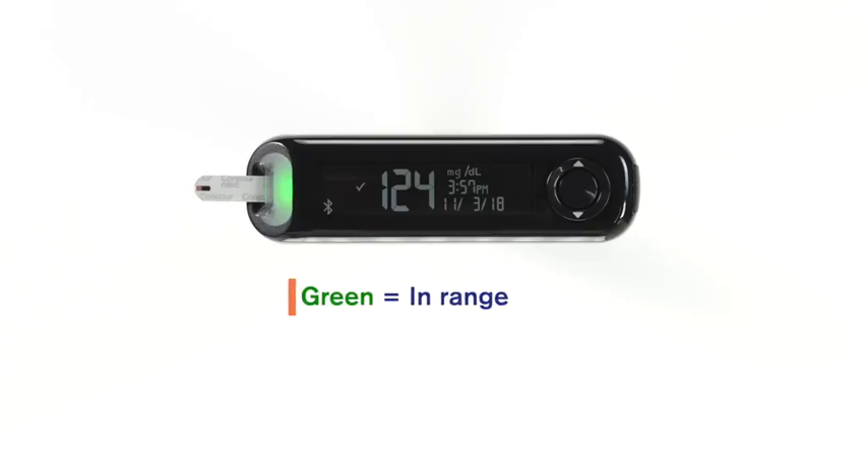Target ranges entered on the PDM will activate the Smart Light feature on the meter: green equals in range, amber equals above range, and red equals below range.